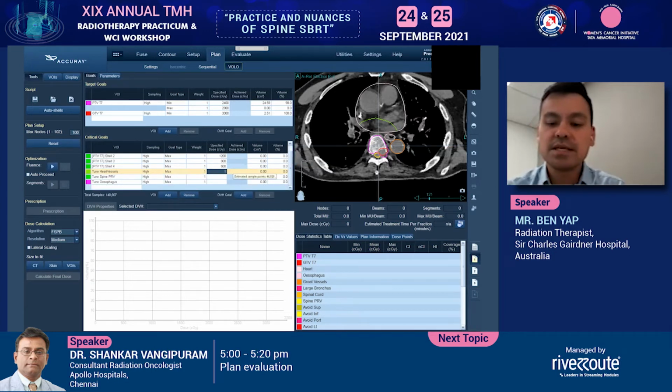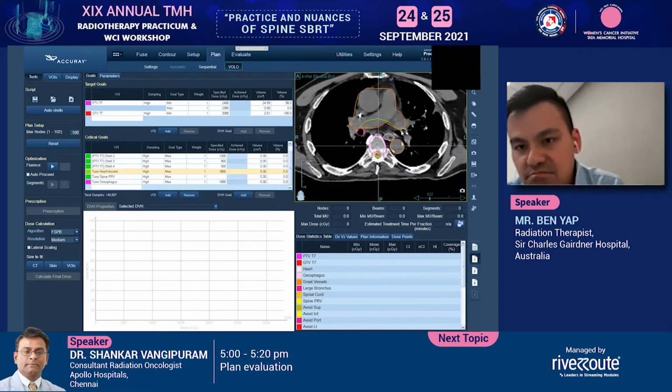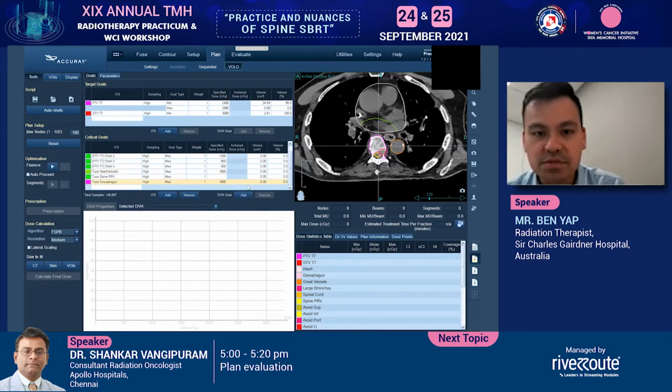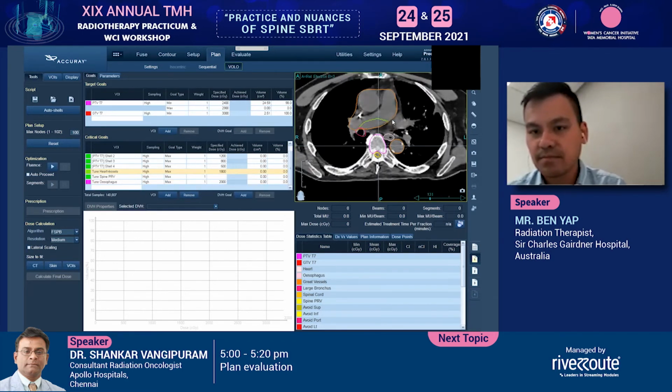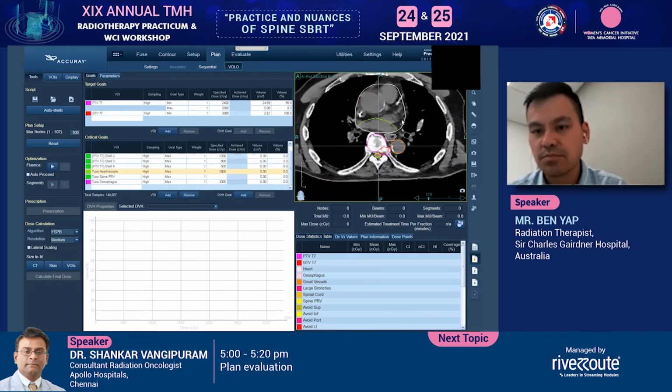So just approximately, just because I know the plan off by heart, I'll go back to the spine later. I'm putting 18 because I know that this wants to be 24, so I can probably drop about, this one's quite adjacent, so maybe I'll just put 20 for that. It's not too far from bronchus, won't bother.